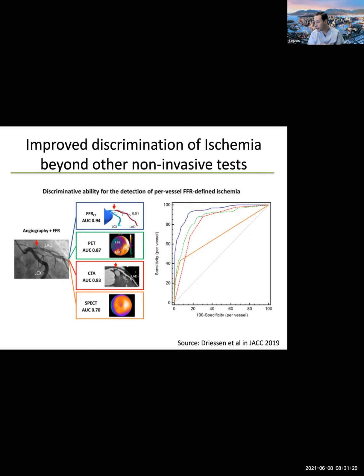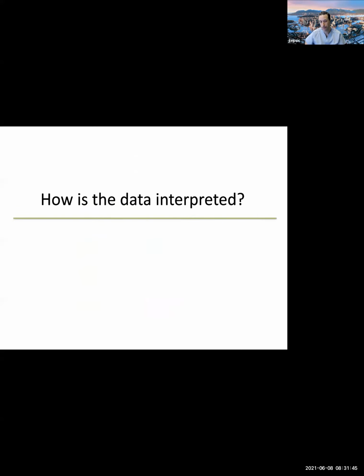Whereas if you send a patient, of course, to the cath lab with an abnormal PET, you could tell your interventionalist that she's likely to find an LAD lesion, but not how long the lesion is, where the lesion will be, or whether she needs to be prepared for lesion preparation and rotablation or not. So I think therein lies the real opportunity of CT and then limited use of FFRCT when needed.